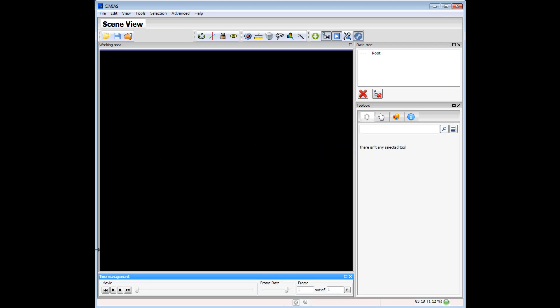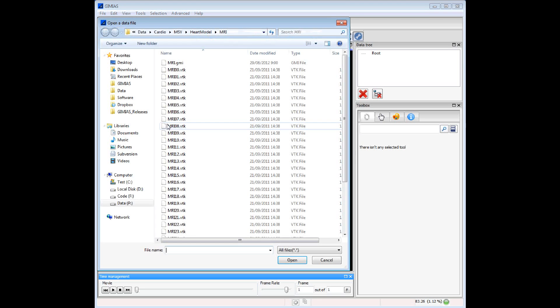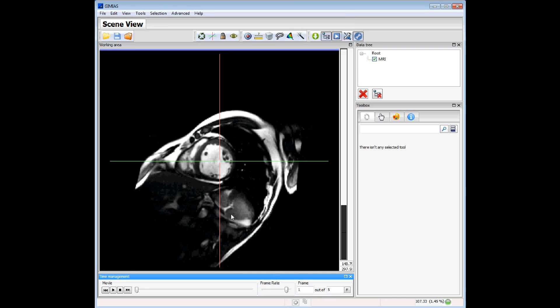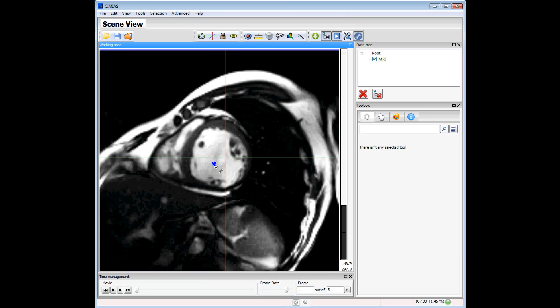The contour segmentation allows segmenting an image using a contour defined by a set of control points. The first thing is to open an image. This is an MRI image of the heart.